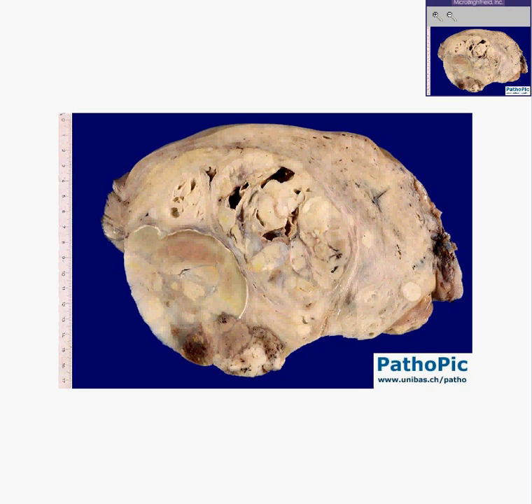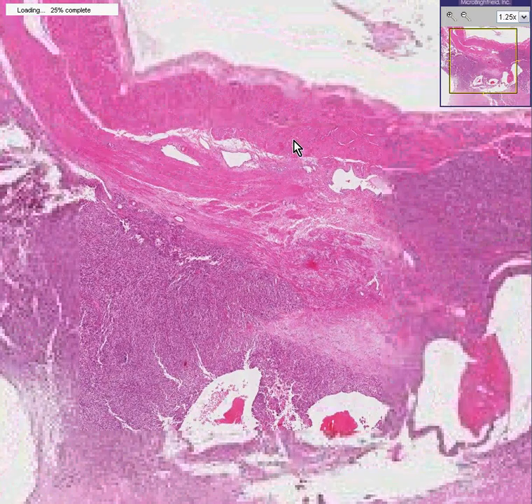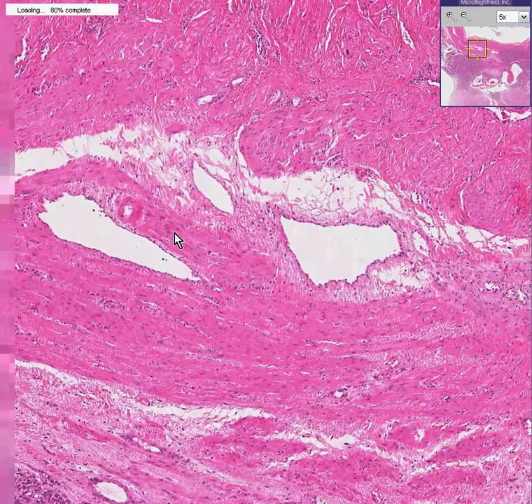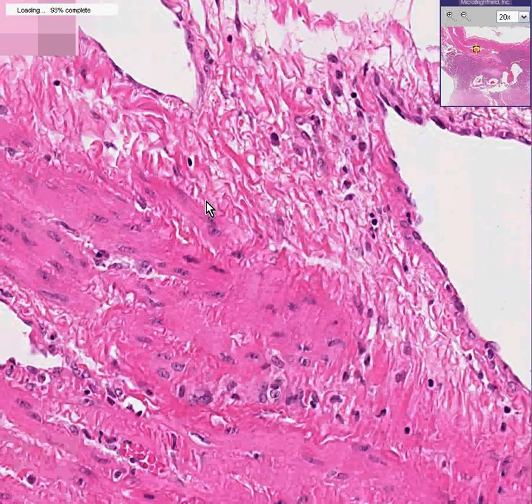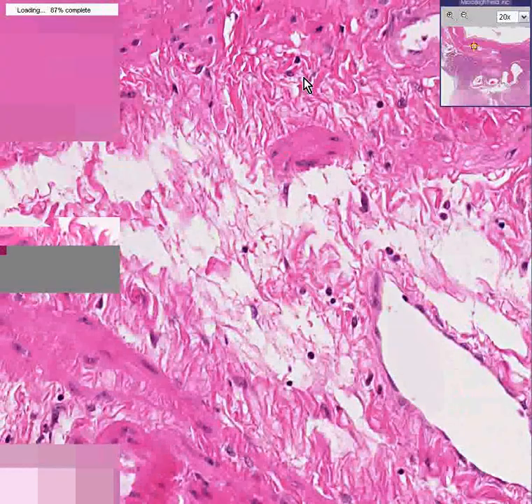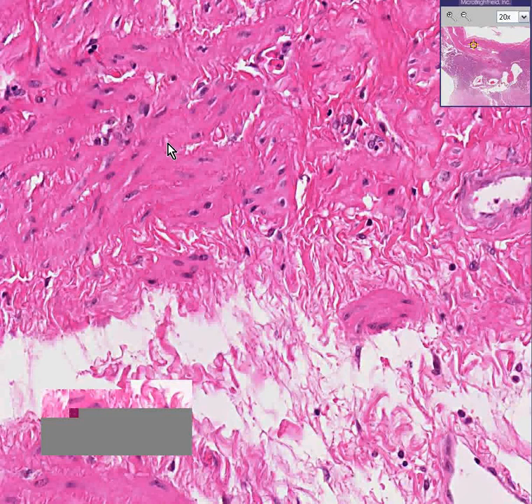So let's take a little microscopic view. Here is the cut section. Here is an area of normal myometrium because it looks like absolutely classical normal smooth muscle cells. You can see up here they're nice and spindly, but the main thing I want you to notice is that in this high power view we could go to 10 or 20 fields and maybe see zero or maybe one mitosis. There aren't any, and in addition they have plenty of cytoplasm.